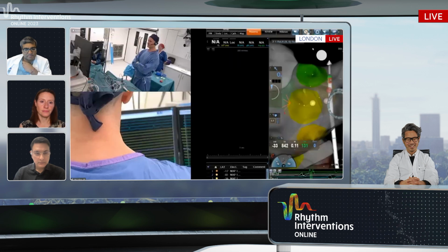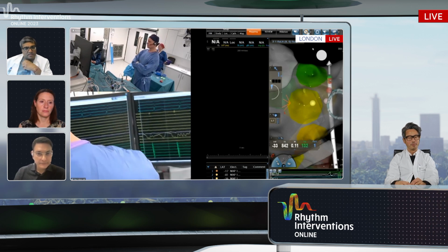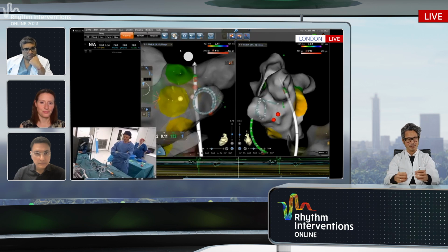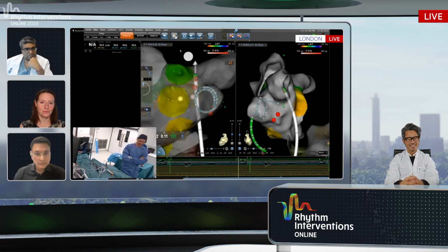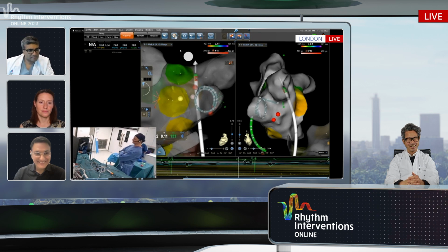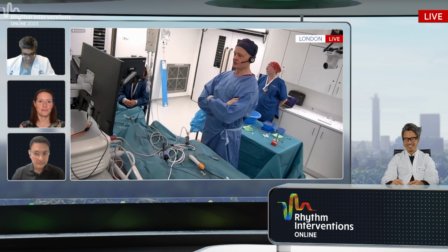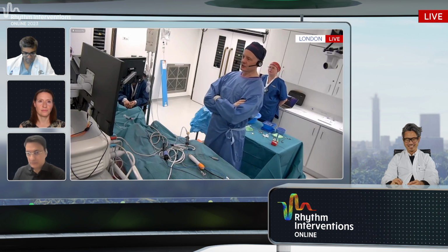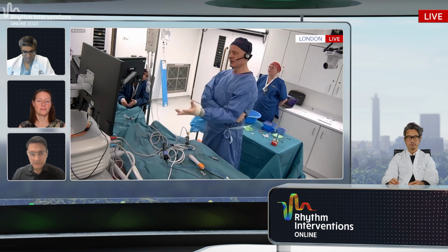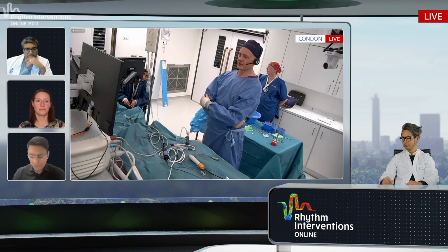So is there anything else you guys want me to do? Would you try and induce another flutter? Exactly. Bringing up the question of induction and doing more mapping and looking for anything else. I'm an Atul Verma disciple, and I'm a great believer that less is more. And so I always think every lesion I give has the potential of causing more trouble than it's worth. So in this situation, I wouldn't, because he's coming in a clinical tachycardia. As Vivek says, we've got a putative reason why it may have initiated. So for me, I'd stop here.